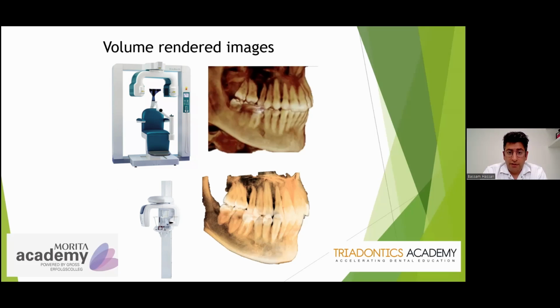And the first thing that you would notice between the two images is that actually there is very little difference. So we had excellent image quality with the high-end cone beam CT systems more than 15 years ago. They did not improve, and for the same reason that CT scanning remained stable for the last 20 years.